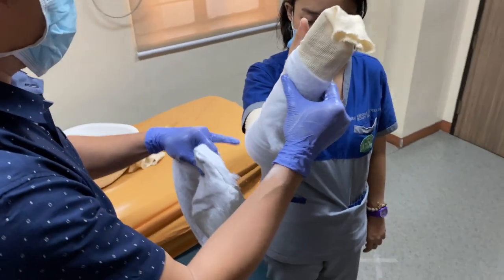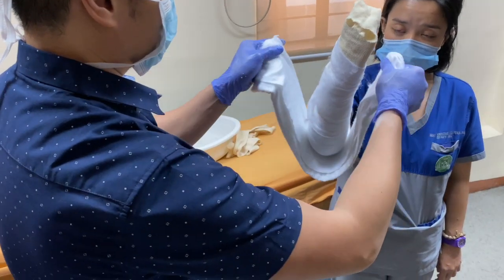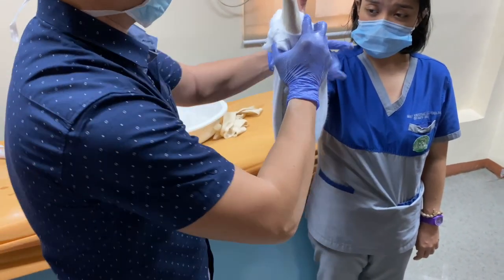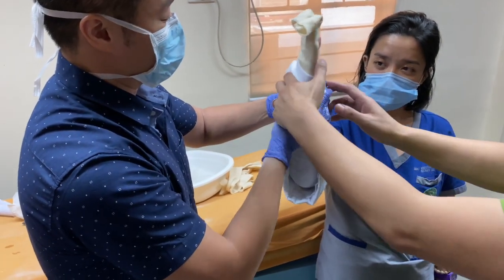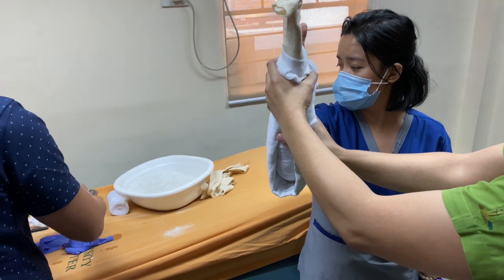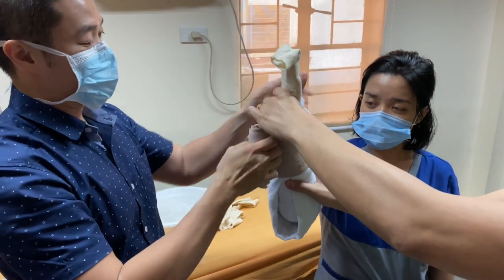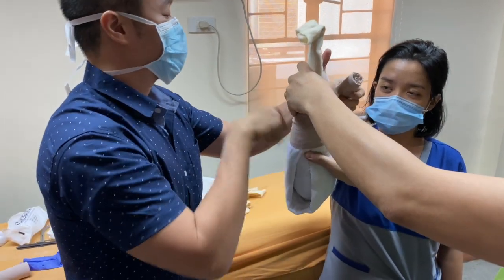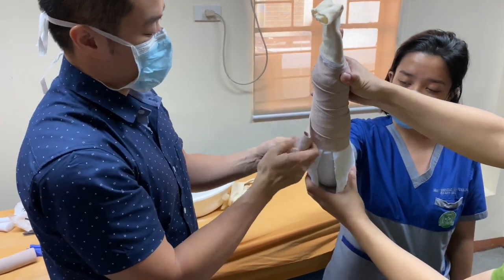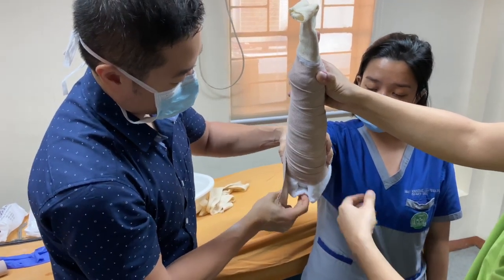Now we're ready to apply it. Maintain the limb in the neutral position — ask the patient to position it the way you want it immobilized. Have your assistant hold it for you while you apply the elastic bandage. Start distally, applying it a bit tight so the splint molds and follows the contour of the limb. Later, when this has set already, we will adjust the tightness — this won't be the final tightness.